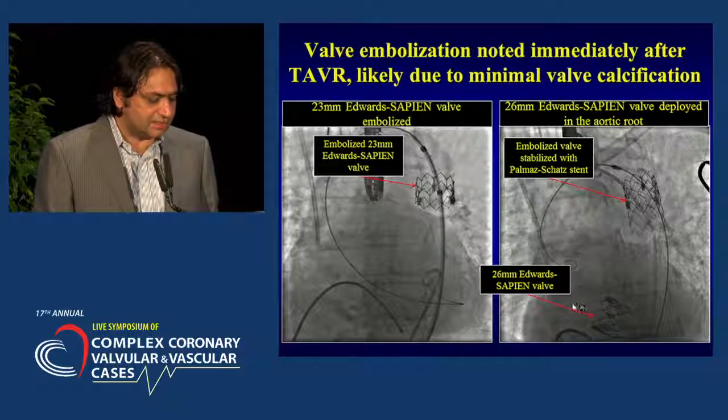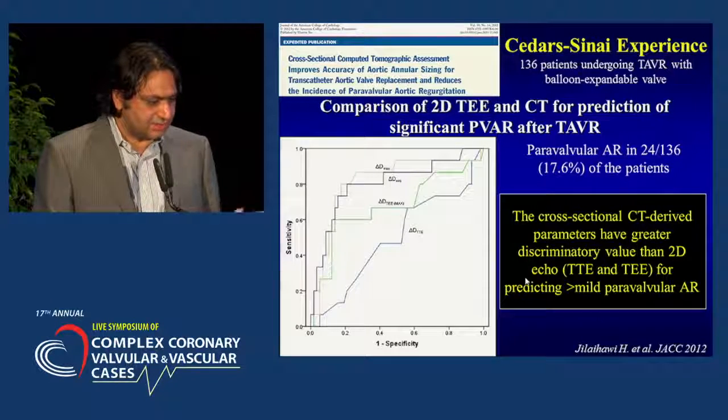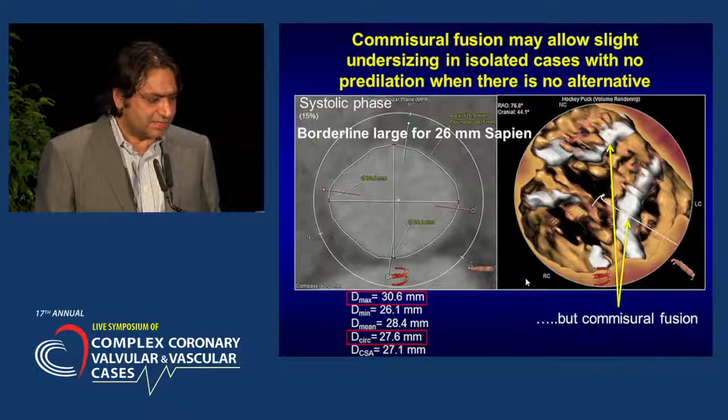We went back and did another valve there. And actually got the case done. So there was an example of low calcium. So I'm just going to skip. So there are things that we look at on these volume rendered images that actually help us.